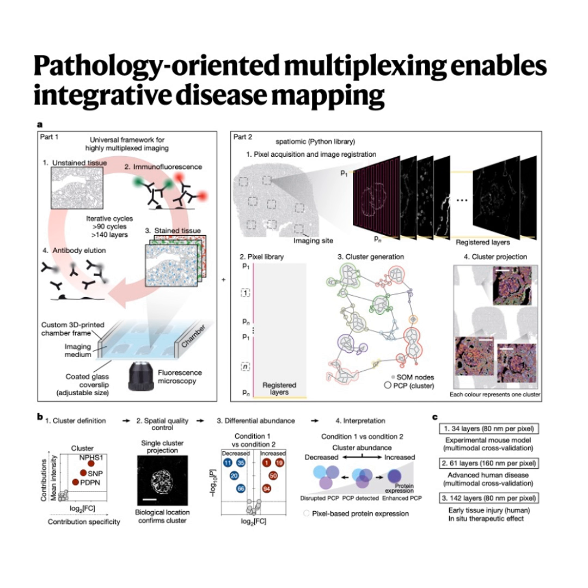Let's start with 4I. If you're staining and imaging 95 times, how do you avoid signal bleed-through? How do you make sure the signal from cycle 10 doesn't mess up cycle 11? And how do you keep the tissue from just disintegrating or floating away? Yeah, those are the key practical hurdles. The signal cleaning part relies heavily on the elution step. After each round of imaging, they wash the tissue with a pretty specialized chemical buffer.